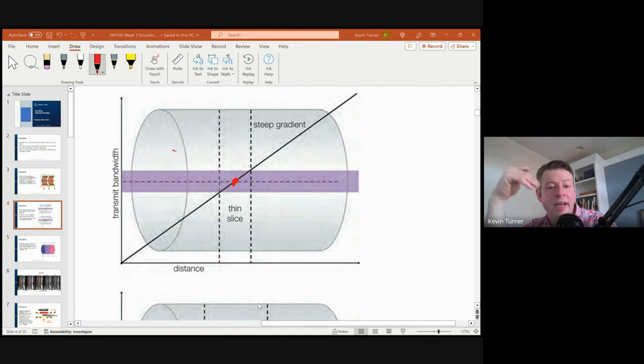So when we want to scan a patient in MRI with a pacemaker, the manufacturer comes in, turns the pacemaker off, and you have to have the manufacturer there. You don't have to have a cardiologist, but you have to have a nurse present who is tracking the patient's cardiac status. They will have the ECG on the patient and they'll be checking their heart. So in case there is some kind of cardiac event while they're in the MRI, you know immediately and you can go in and help the patient. Because if you left the pacemaker on, the gradient would fry it. The gradient would destroy it. Yeah. So that's how we do pacemakers.